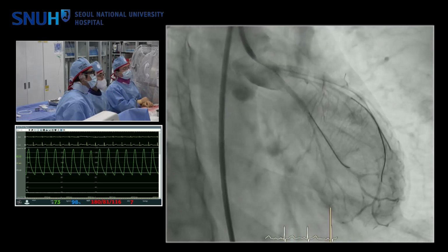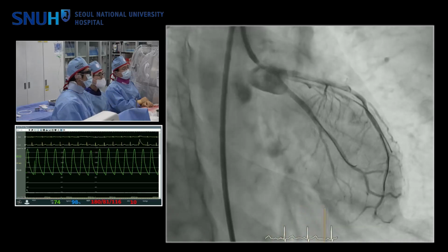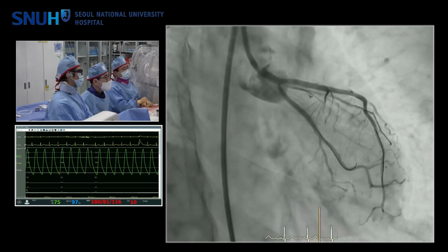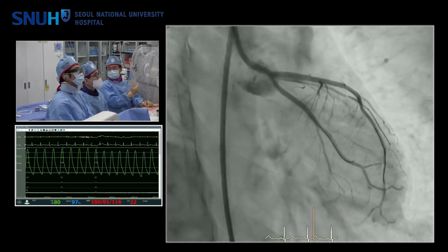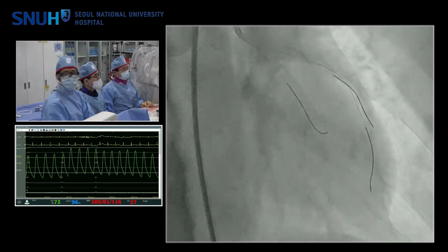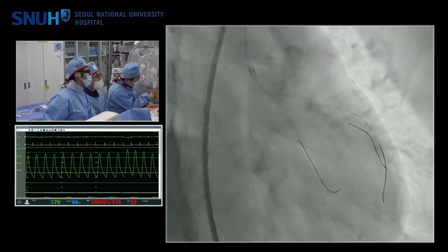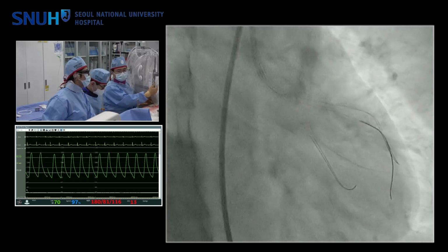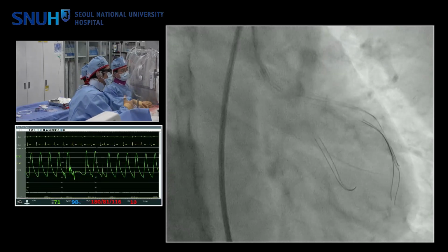Then this is the first angio after stent. There is some pinch of circumflex ostium. The flow to ramus intermedius is maintained. Is there any other good angle to separate three branches? Caudal? Maybe LAO caudal. Okay, take a picture.